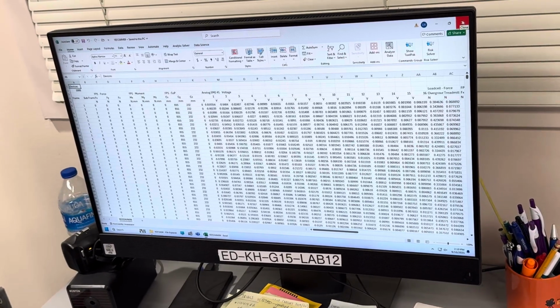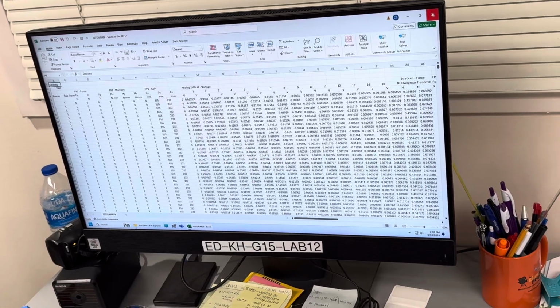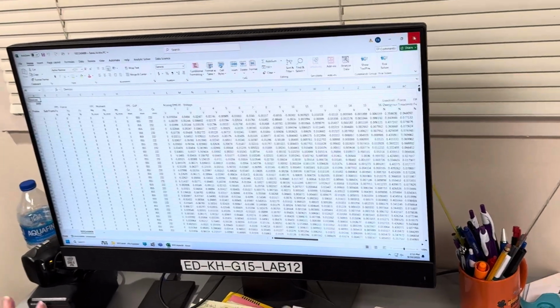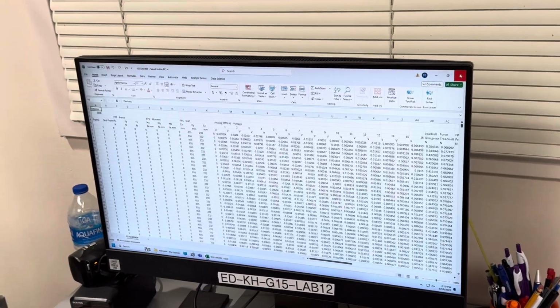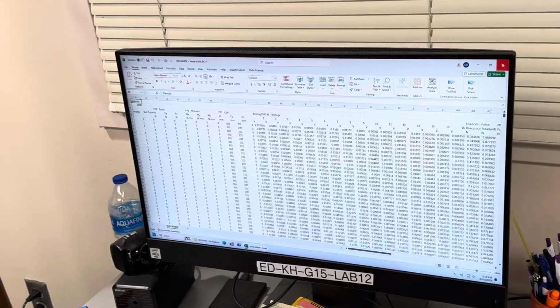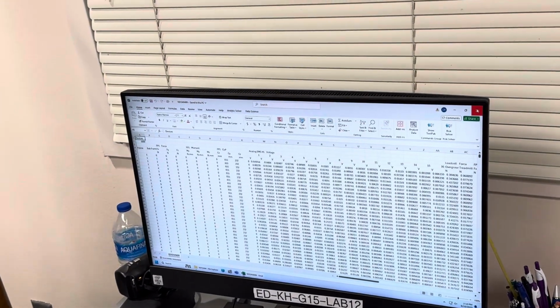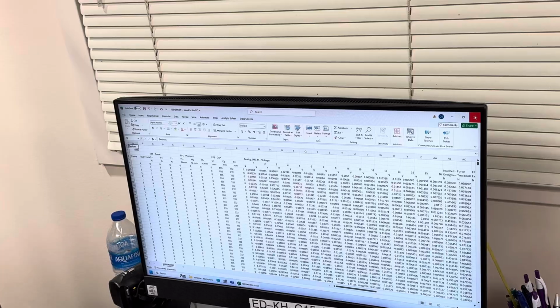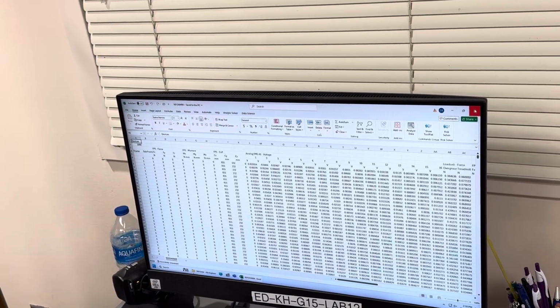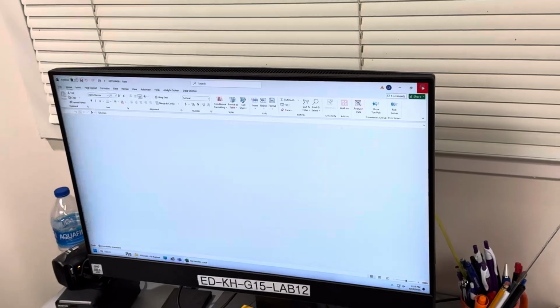So pretty much our process here is we collect the data. Somebody will do the Vicon processing, so someone will be assigned. You can see up there at the top of Diane's list, it was a subject ID, NCI Vicon. So she did the labeling and the gap filling for that subject. And then the next step is to do step time. You can see the bottom of Sarah's list, I've put that same subject, but it says step instead. So that's the next part of the process. Once the Vicon is done, then we can move on to step times.